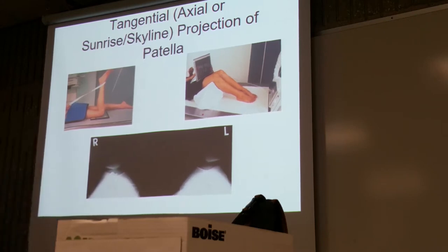Okay. But here's the other thing. If you knew somebody with a known patellar injury, would you have them bend their leg like that? Probably not. So there's probably some kind of condition going on, but it's nothing too major, because if it was major and you have them bend their leg like that, it would actually cause separation of the patellar bone. And this is why we communicate with our patients.